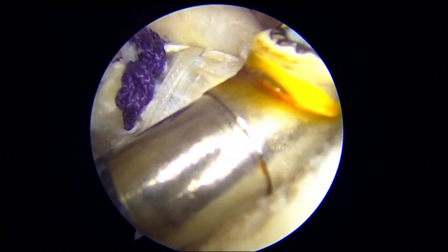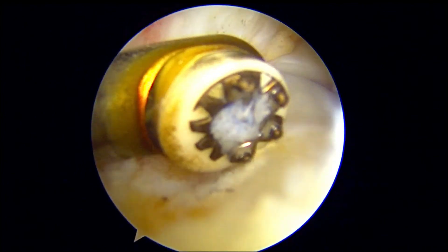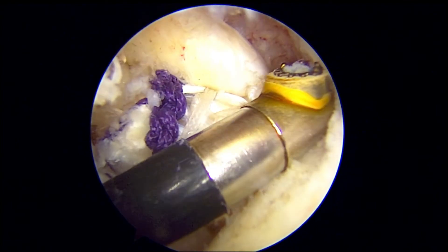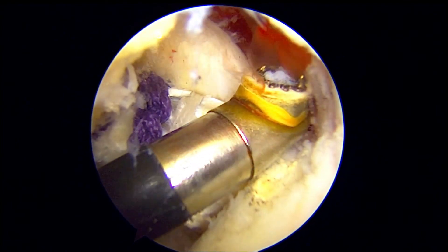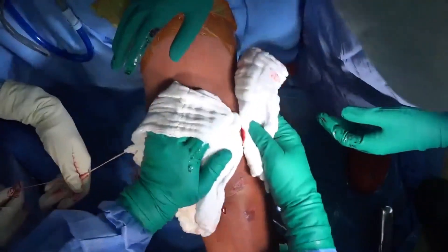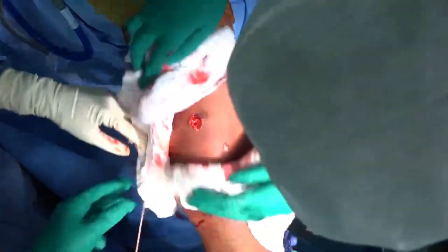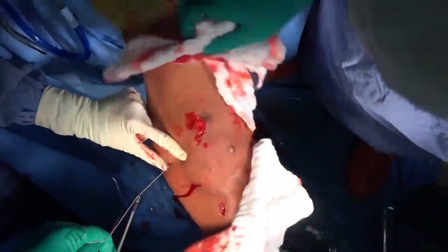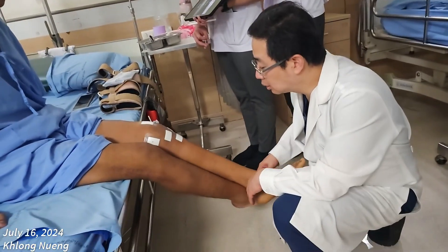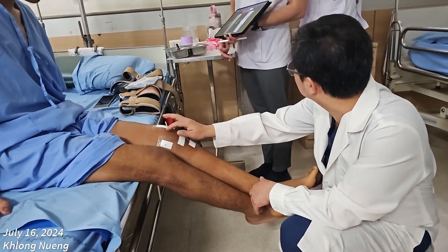The PCL graft is visible along with the preserved remnant PCL. The tension of the ACL, which was previously buckling, also appears to have returned. The tourniquet is then deflated while intra-articular bleeding is controlled. After that, a gentle massage is performed to expel any remaining fluid. This is done to reduce effusion, thereby minimizing postoperative pain and enabling quicker mobilization for the patient. Post-reconstruction hemarthrosis is also believed to cause arthrogenic muscle inhibition. The day after surgery, the patient exhibits good leg extension strength.